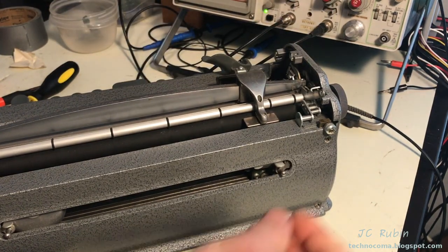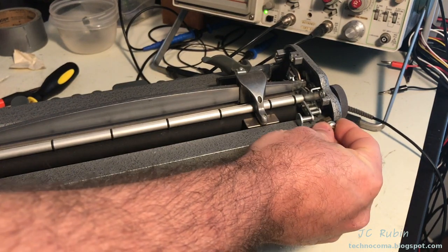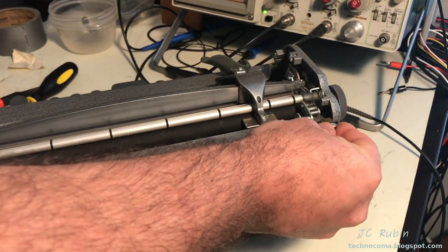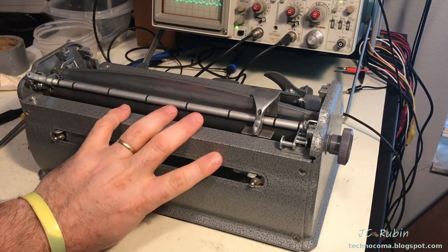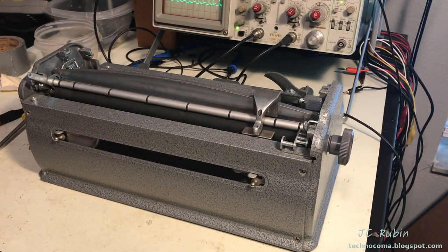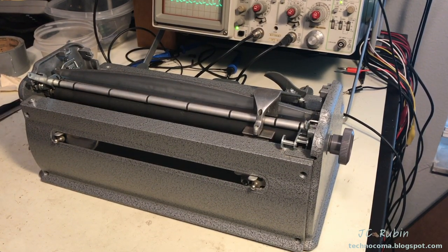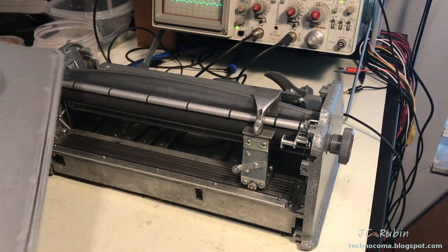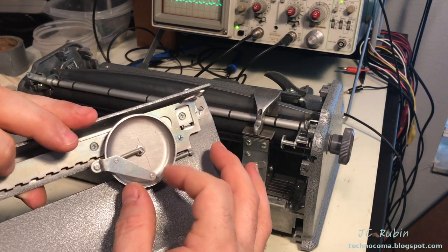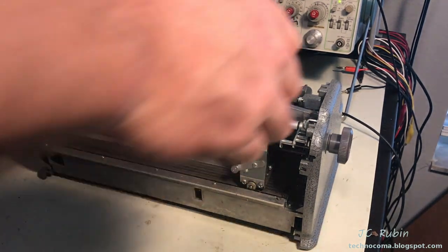Turning the machine around, on the back of the unit is a gnarled round wheel called the paper stop — it lifts right out. Now I'll remove the back plate, which has four screws. With those removed, the back plate comes right off along with the associated bell. I'll put that off to the side and flip the unit back around.